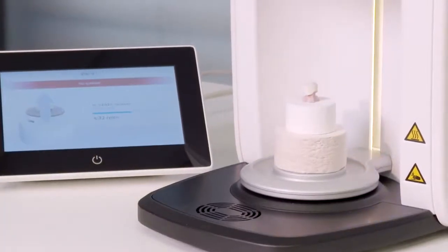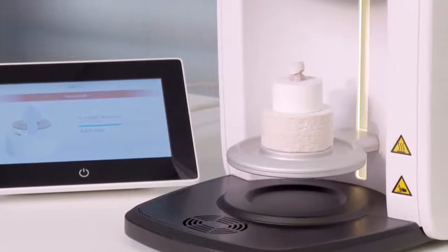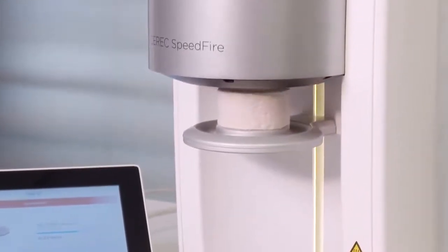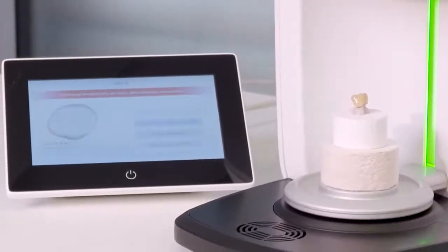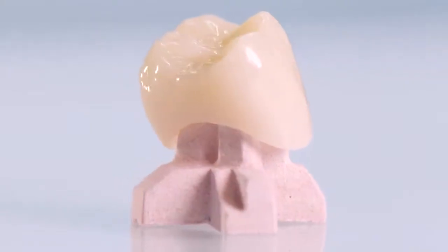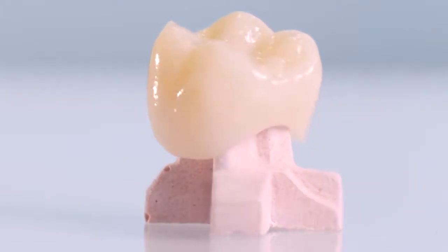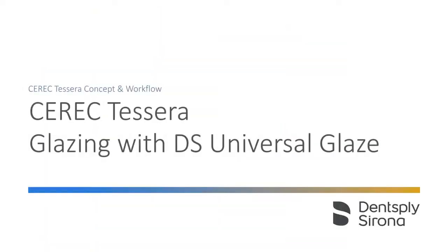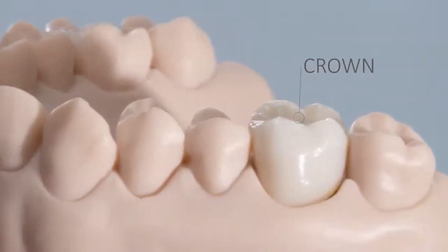The spray glaze program can now be started in the preheated Cerec Speedfire. After approximately four minutes of firing time and cooling of the object to room temperature, Cerec Ticera is already demonstrating its highly aesthetic properties after these few and simple steps. In addition to Dentsply Sirona spray glaze, glazes in paste form are also available for the same aesthetic results.